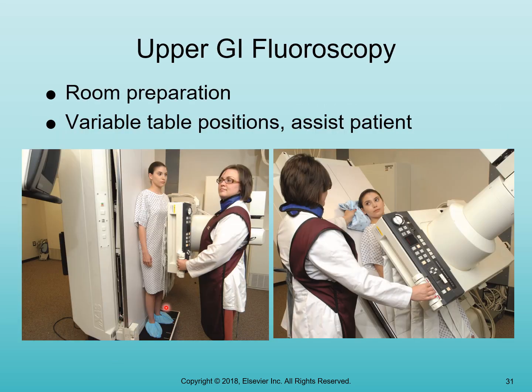Here we have a picture of the footboard that the patient's standing on. We can see the bucky is here, but again, it's not all the way down because this bucky slot shield is not all the way fully extended. The monitor is there so that we can see exactly what's going on when the patient does drink. This is the control panel for the fluoro tube, which is located under the table.